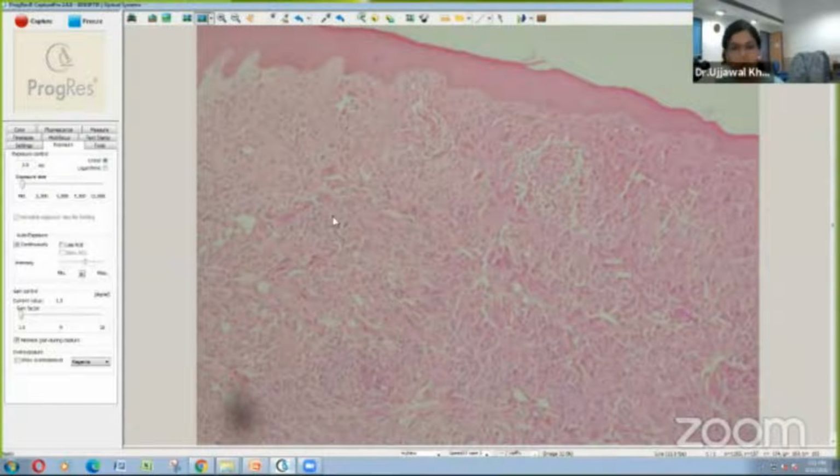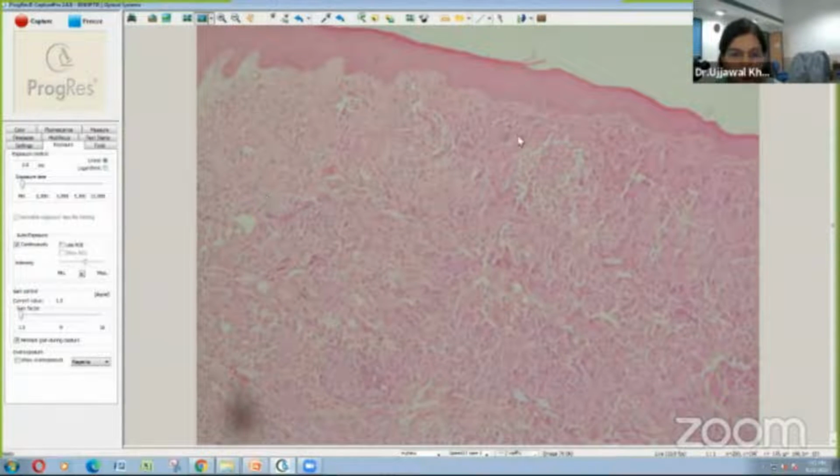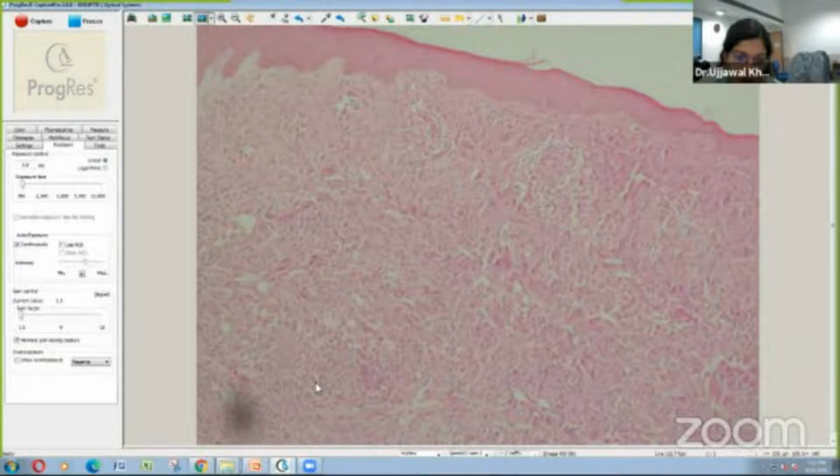So these are the granulomas. These are ill-formed granulomas. This is the punch biopsy from the lesion. This is a skin biopsy covered by epidermis, with some vacuolated cytoplasm and flattening of the rete ridges, which pointed us to the underlying dermis, which shows a diffuse, dense infiltrate composed of histiocytes, lymphocytes, and macrophages. Here we can notice some ill-formed granulomas.